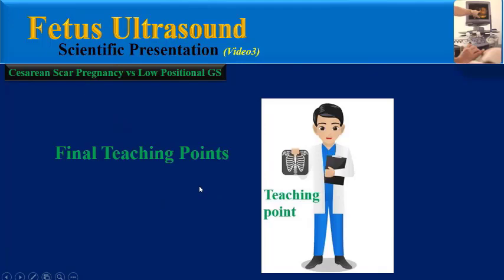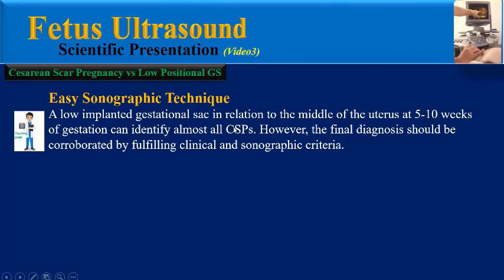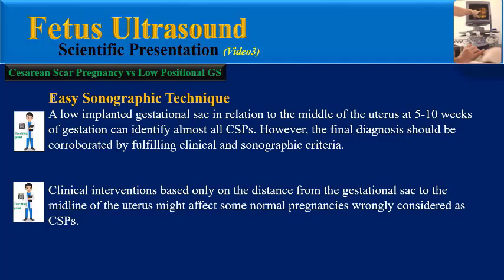Now, please pay attention to these final teaching points. According to the easy sonographic technique, the location of the center of the gestational sac relative to the midpoint axis of the uterus can be used as an easy non-invasive method for sonographic differentiation of IUP and CSP in early gestation. A low implanted gestational sac in relation to the middle of the uterus at 5 to 10 weeks of gestation can identify almost all CSPs. However, the final diagnosis should be corroborated by all fitting clinical and sonographic criteria, as clinical interventions based only on this distance might wrongly classify some normal pregnancies as caesarean scar pregnancies.